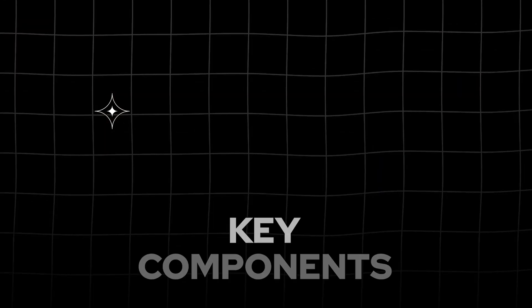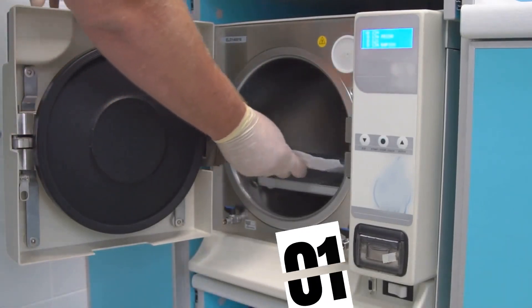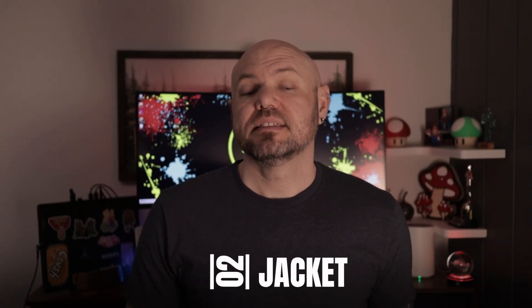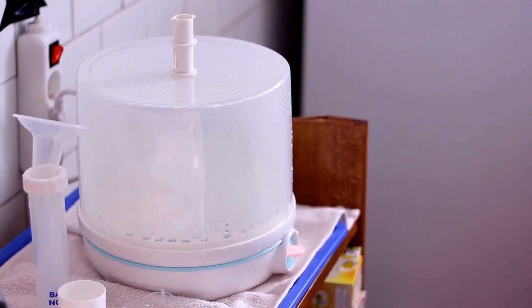Before we get into the cycle process, let's look at the key components of a steam sterilizer, starting with the chamber — the sealed compartment where instruments are placed for sterilization. Next is the jacket, the space that surrounds the chamber and fills with steam to prevent condensation inside the chamber.